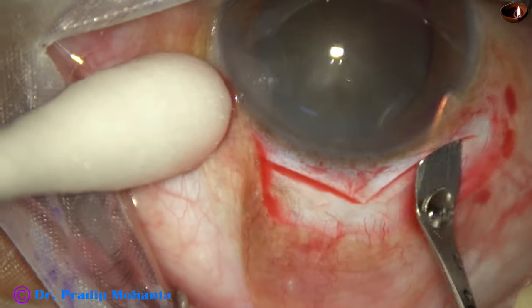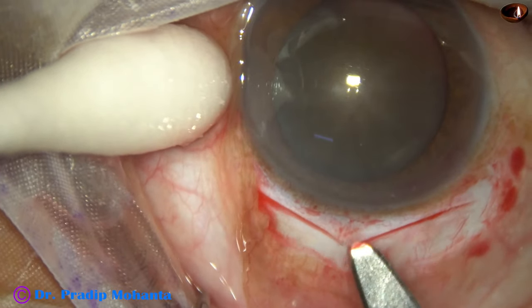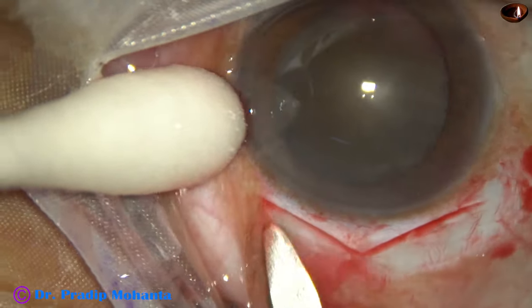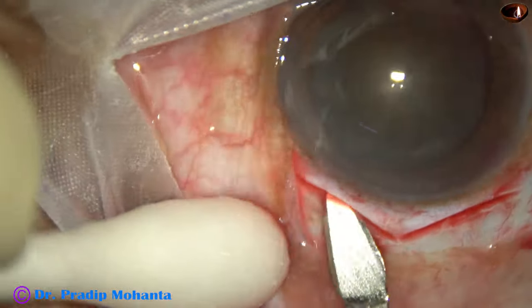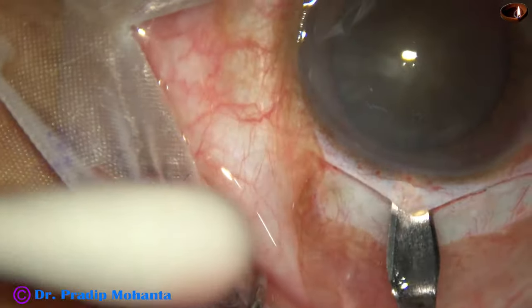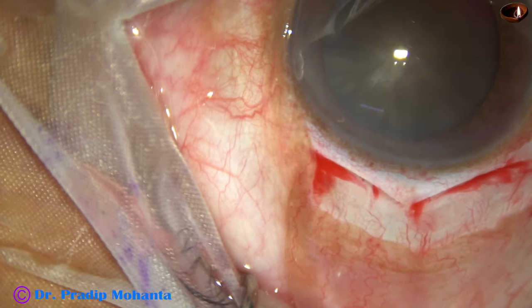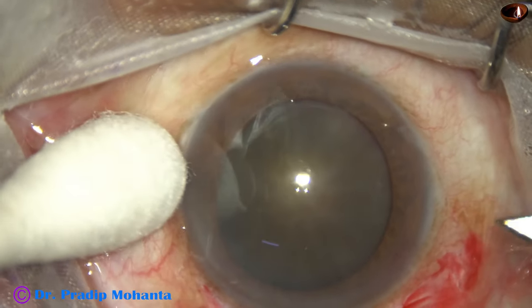Sweep backward and to the right side, then sweeping backward and to the left. We have to remain at one plane from one end to the other end. The size of this incision is about 10 millimeters — 5 plus 5 — and the inner opening will be about 11 millimeters.